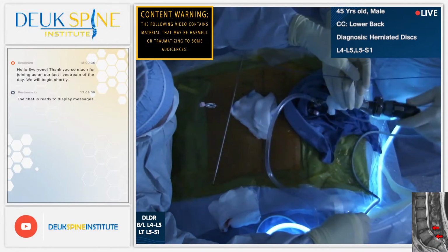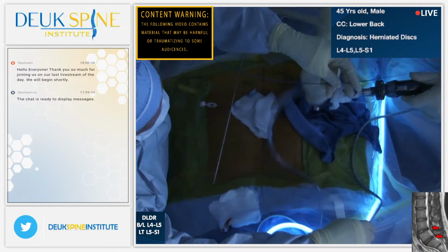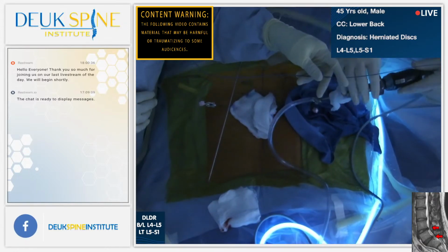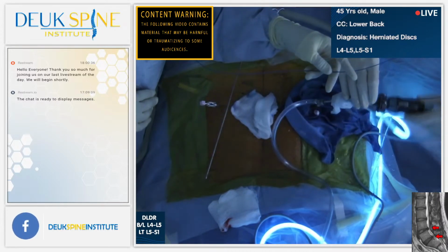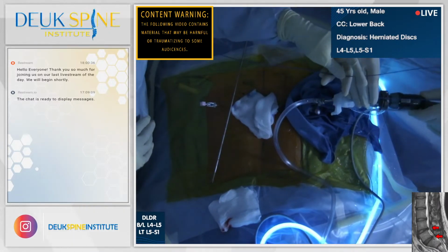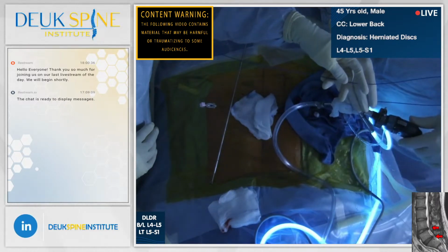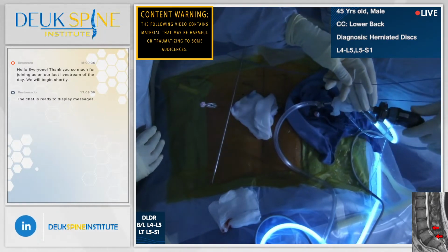Man, what a tear right there, huh? All right, there's more tear right there. That is the needle from the other side. Look at the tear. That's the tear we're here to fix. You see the blue stuff in the tear, that is the herniation. We want to get rid of that. Getting rid of that will let this disc heal. It will become painless. I'd like to do it without melting any more of that needle.